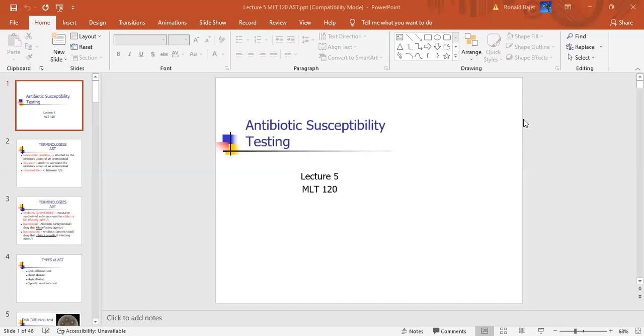Okay, so in the laboratory, we can tell whether or not the doctor is going to be using an antibiotic the organism is resistant to. The doctor doesn't want to give an antibiotic that's resistant, right? Because if it's resistant, that means that the organism will survive. If it's susceptible, that means the organism will not survive. That means it's susceptible, it's sensitive. So susceptibility testing or sensitivity testing mean kind of the same thing. Either way, the organism will not survive.